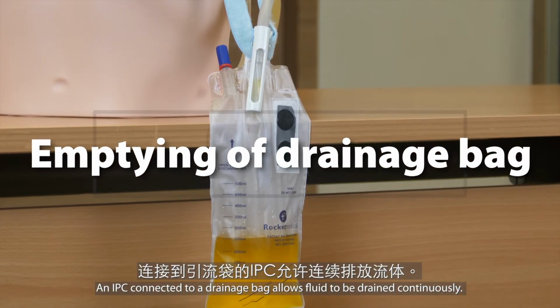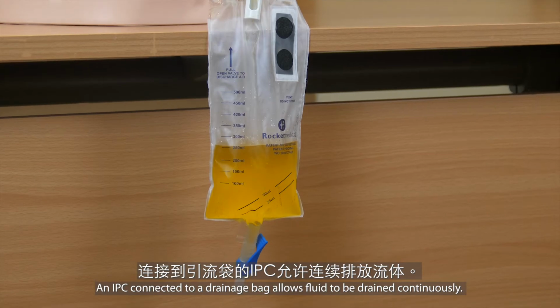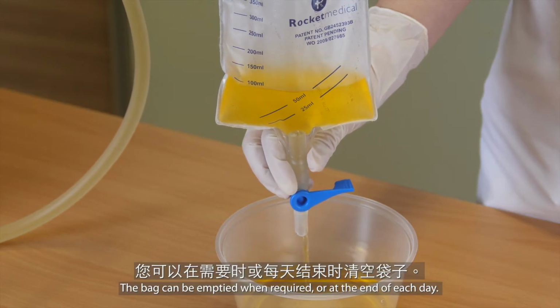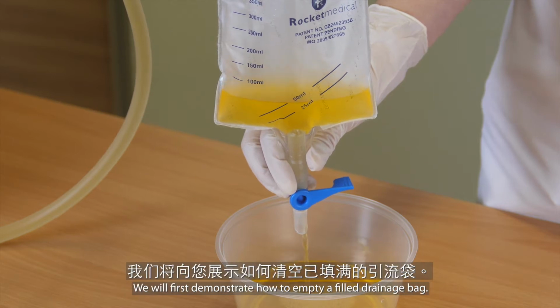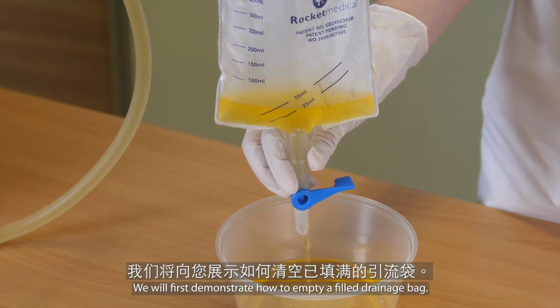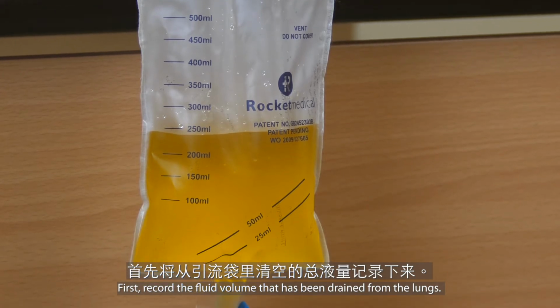An IPC connected to a drainage bag allows fluid to be drained continuously. The bag can be emptied when required or at the end of each day. We will first demonstrate how to empty a filled drainage bag. First, record the fluid volume that has been drained from the lung.